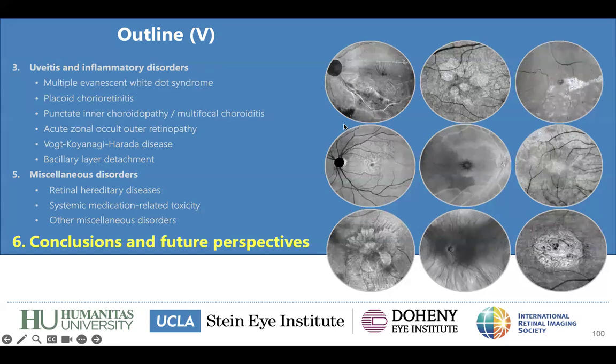Yes. Thanks, Murilo, for the suggestion. Let's do an OCT retinography and orbit atlas. Let's do it. So for the hardware or software, I don't have much experience, honestly. I think it depends a lot on the device.